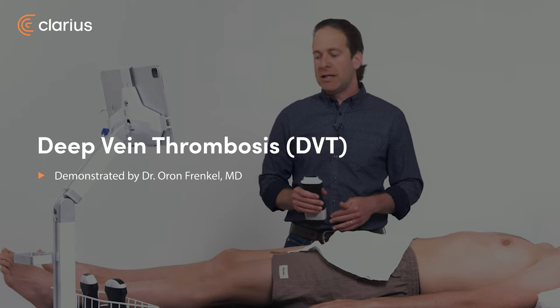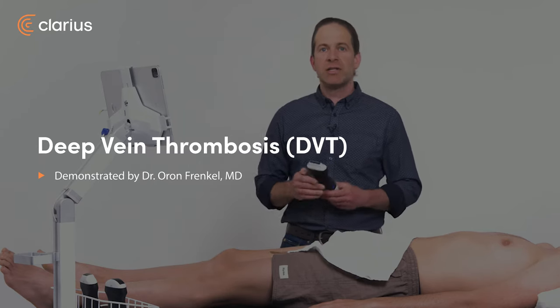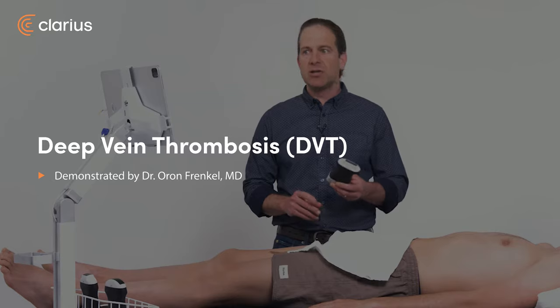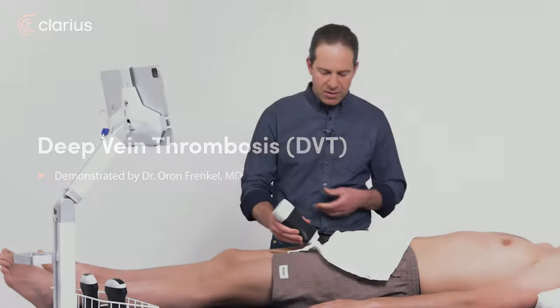In a patient with unexplained leg edema, I can search for a deep venous thrombosis by using a linear scanner on the venous preset.